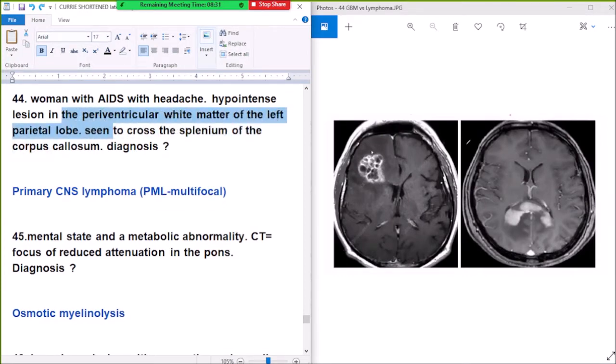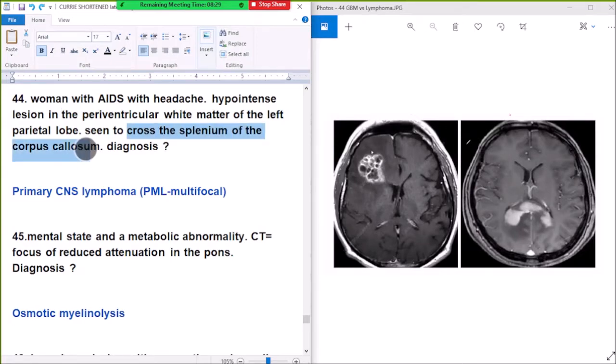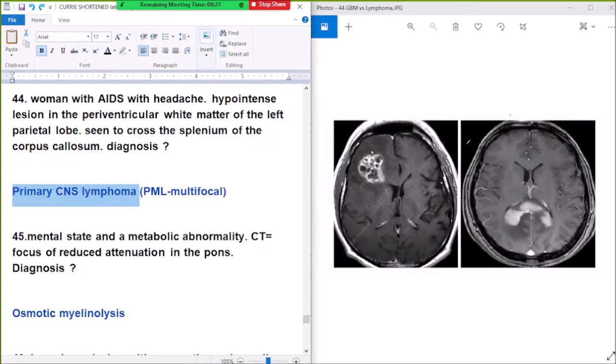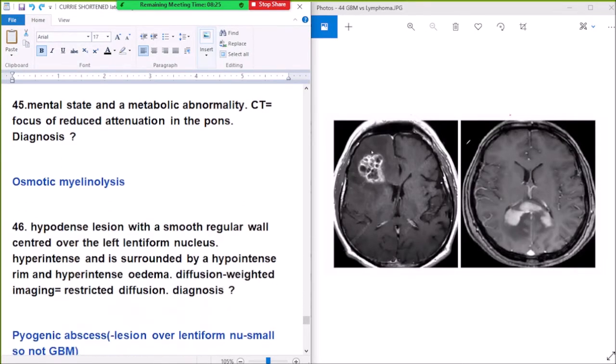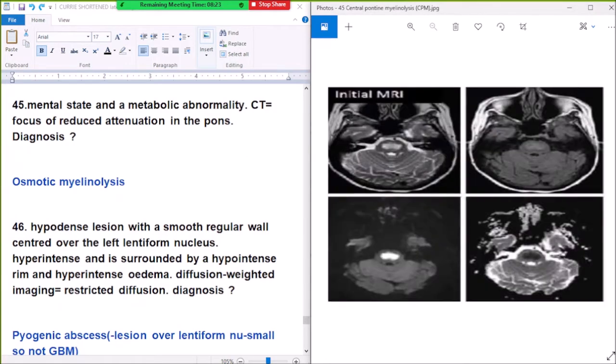Here only a single lesion is seen in the periventricular white matter of the left parietal lobe crossing the splenium of the corpus callosum, so the diagnosis is primary CNS lymphoma in AIDS.